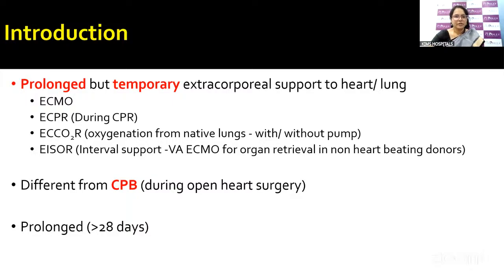Coming to the introduction, ECMO, as you all know, is a prolonged but temporary extracorporeal support to a patient's heart or lung in reversible cases of cardiorespiratory failure. Now, there are multiple terminologies when we talk about extracorporeal support. It is different from the traditional cardiopulmonary bypass that is given during open heart surgery.